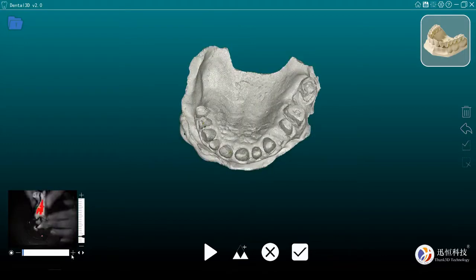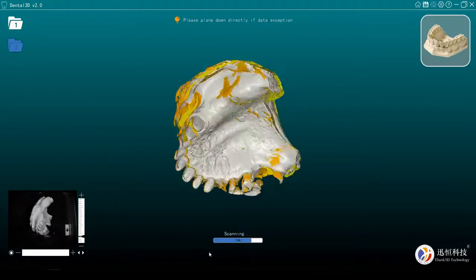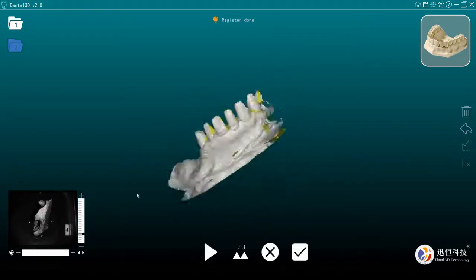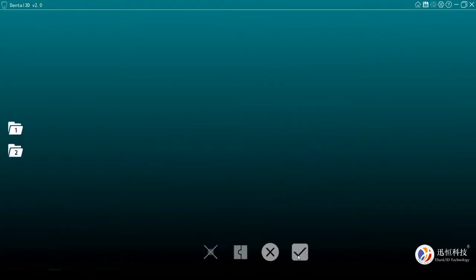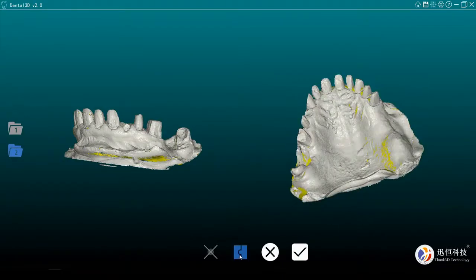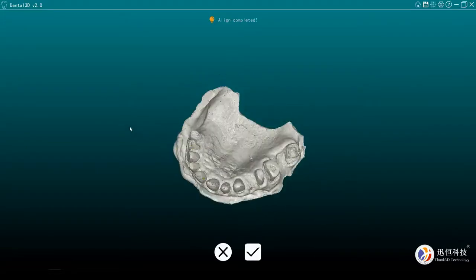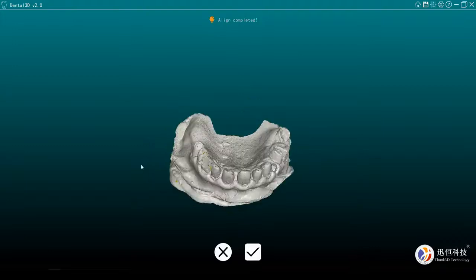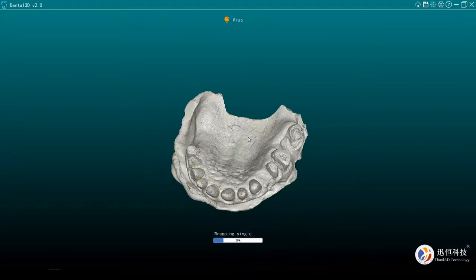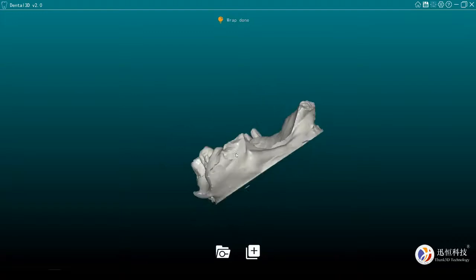If you don't want to add scans, reposition the denture and click scan. It will automatically execute another group of modeling. Then we merge the 2 groups either by auto-align or mark-align. Then mesh it. Now we could see how good the output is.